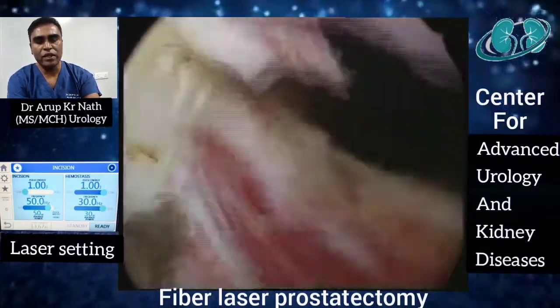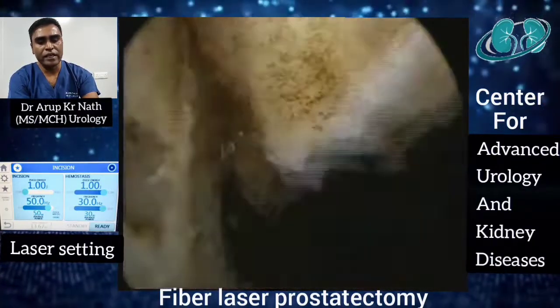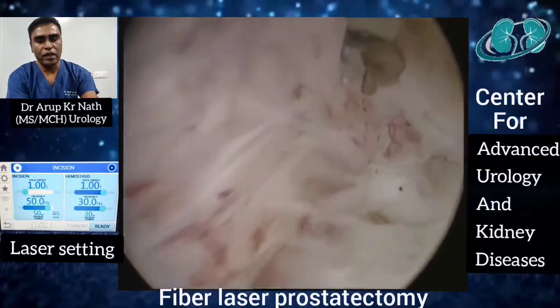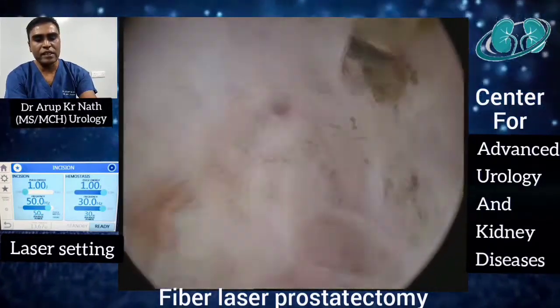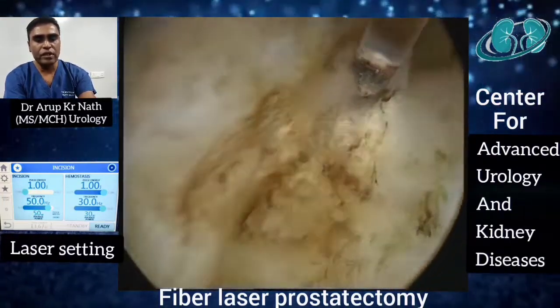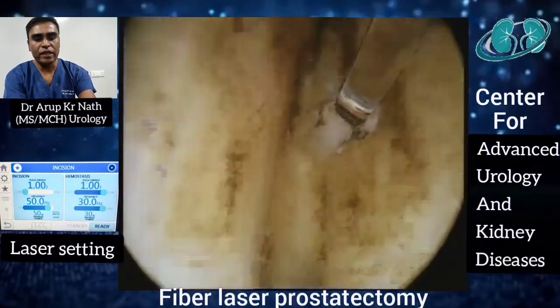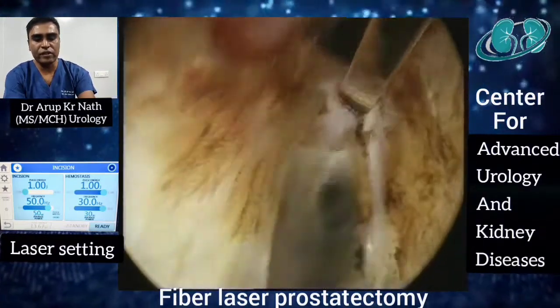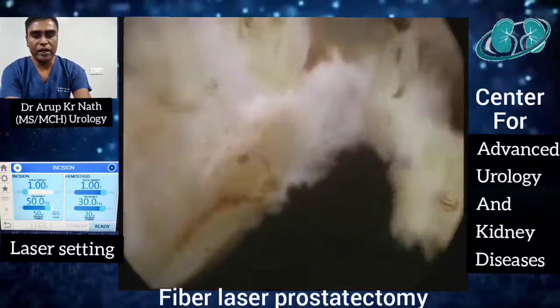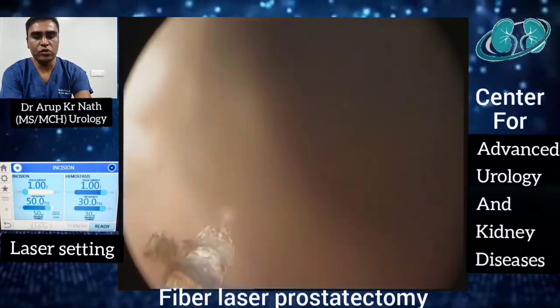The same way as on the left side, we lift up the adenomatous tissue using mechanical force near the apex to get into the plane between the adenoma and the surgical capsule. Towards the bladder neck where adenomatous tissue is less, we activate the laser and use laser energy to split the tissue. Even without direct contact, because of the thermomechanical effect and the vapor bubble, the tissue is split by the energy. The lobe is then completely detached and pushed into the bladder.